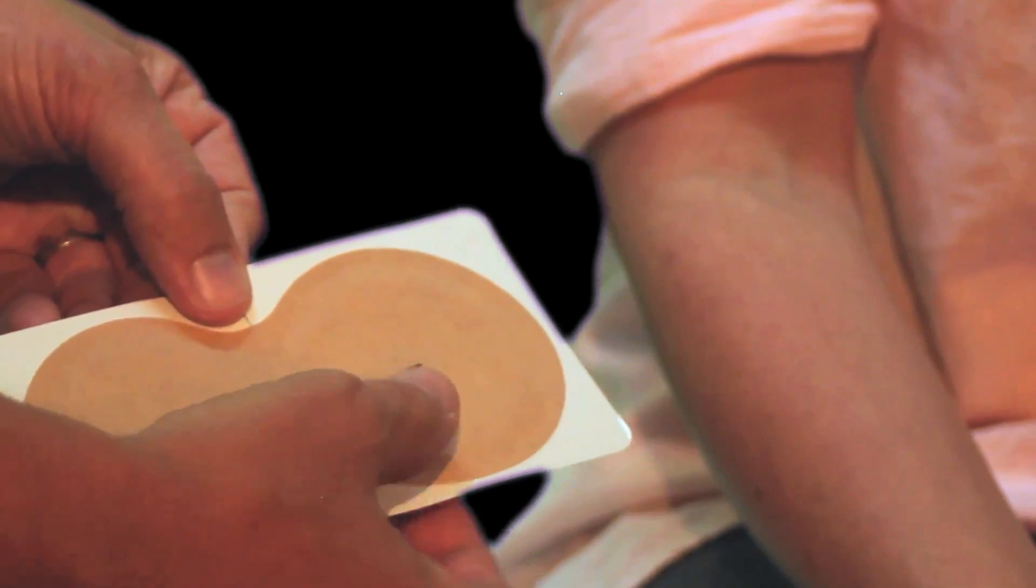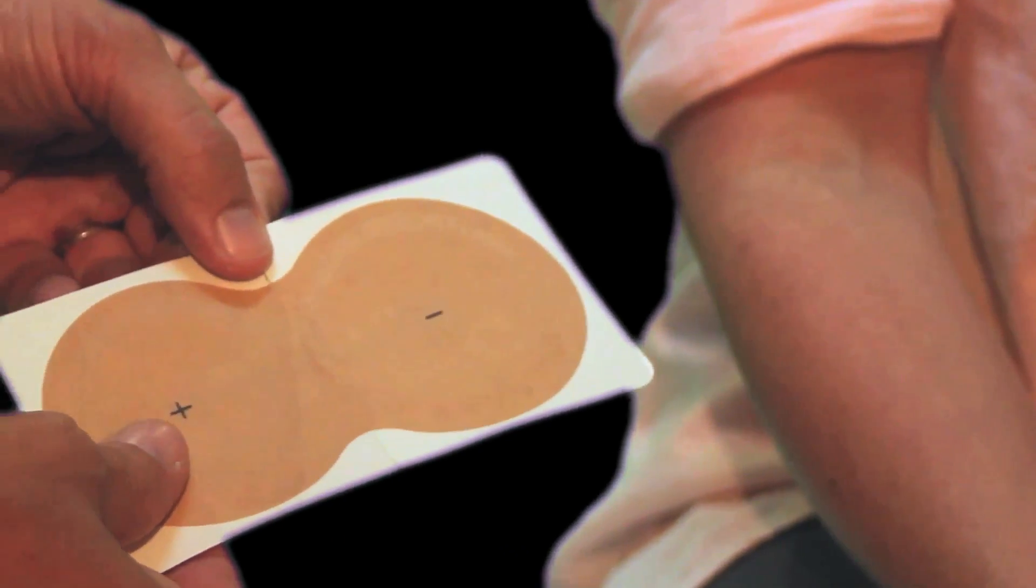If you notice, the patch has a positive and a negative. Positive is where medication is going to be placed.